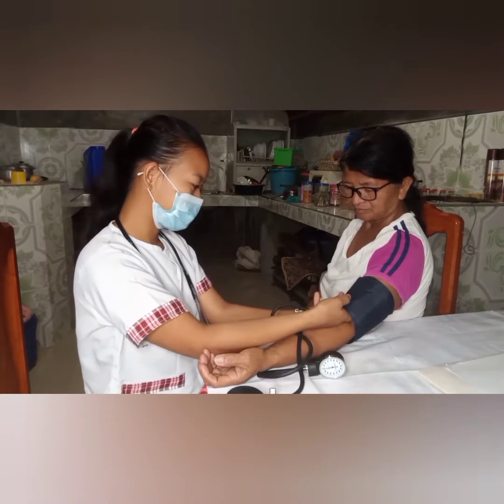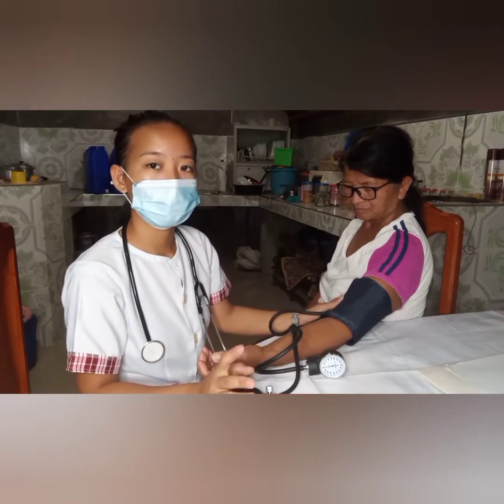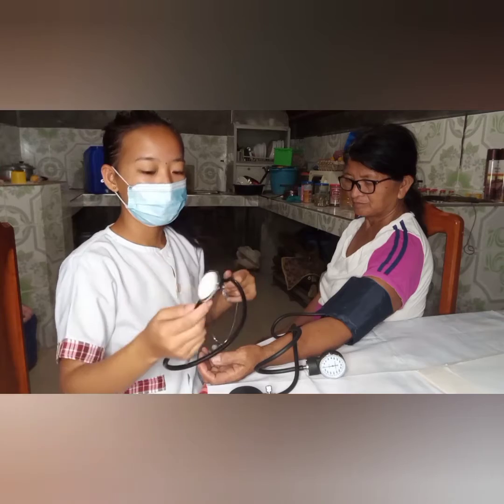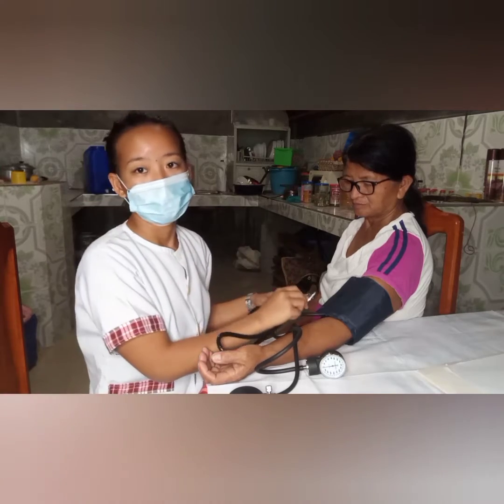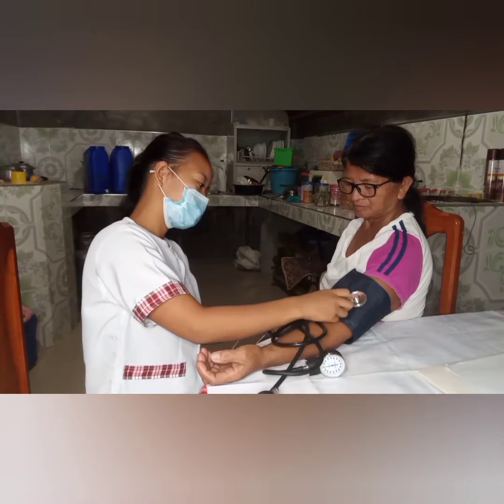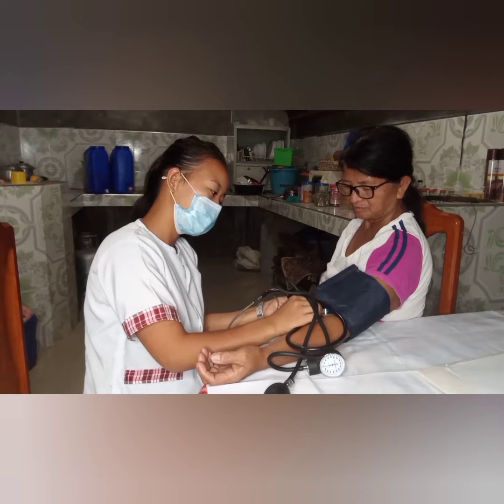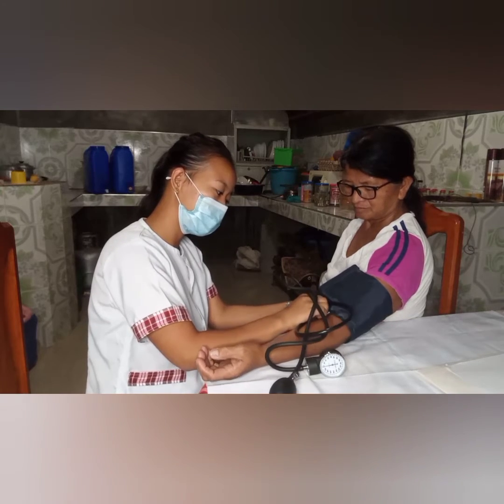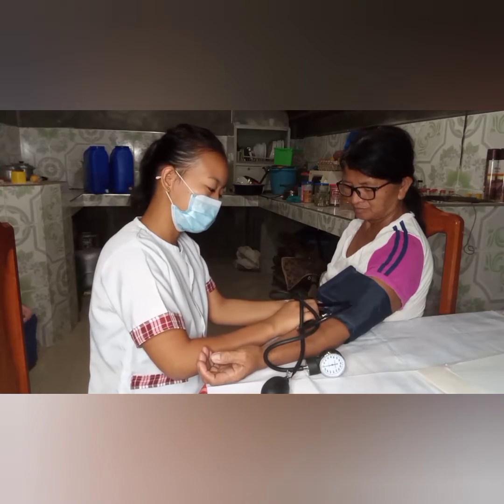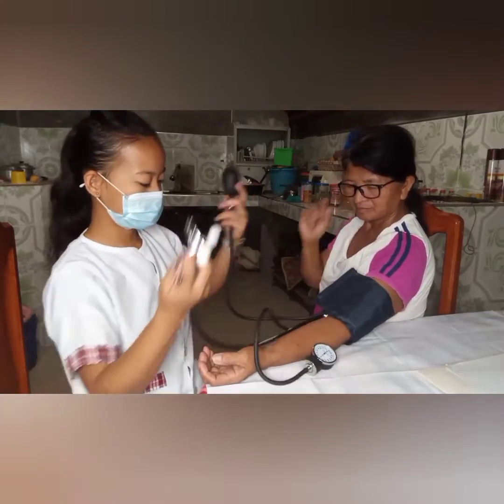Since I have noticed that it's working perfectly, we have nothing to worry about, and we are going to use this stethoscope to hear properly and put it over the part where it says left arm. Put it over here. Why here? Because there is an artery here that will allow us to hear the blood pressure rate of the patient. Let's put it like that.